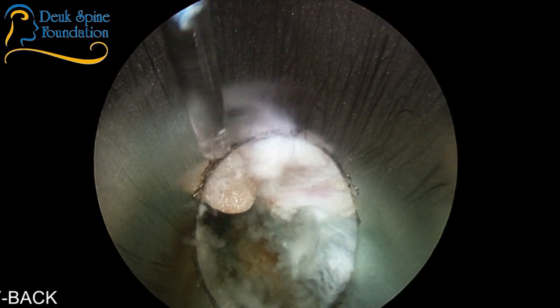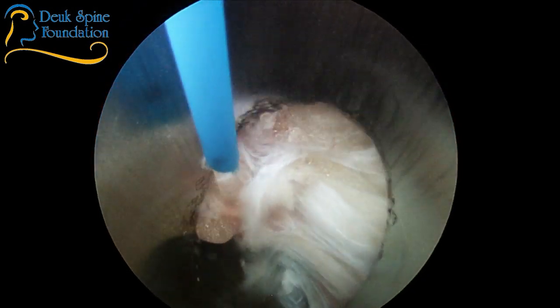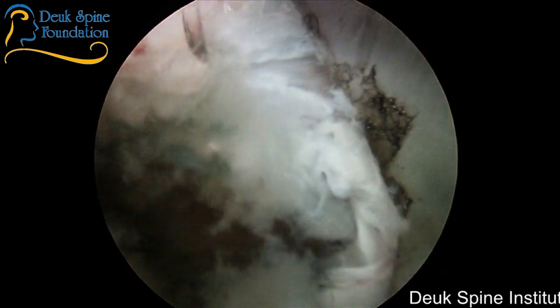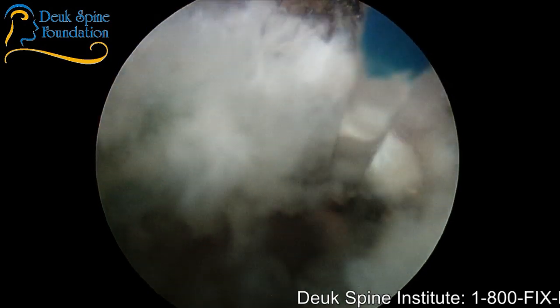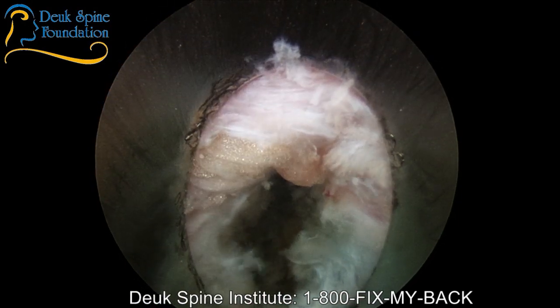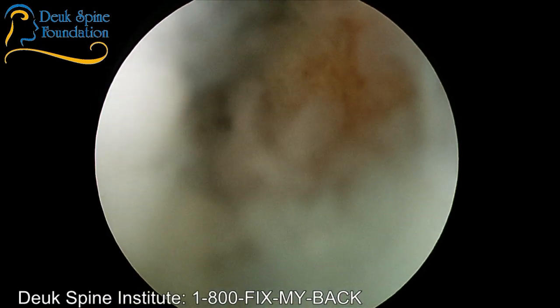And the nerve should be right up here. Let's go take a look. There's the nerve right in there in that fat. Nice and protected. Herniation's gone. And I'm happy. All this stuff will heal nicely in the next few months. So, all done. Laser off. Beautiful surgery. No bone has been removed.